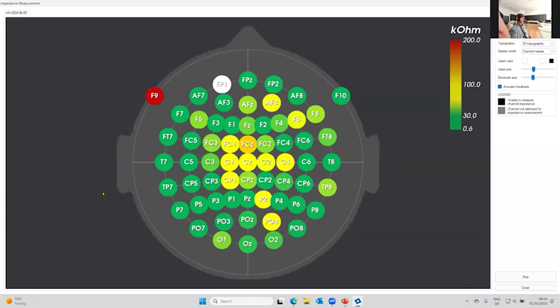Maybe I can show that. So you see the EEG amplifier is over here, the input box, while everything else is on the other side. And now perhaps we can video here. Let's position the coil. And I can use maybe the video from the other one. So let's see. Exactly.